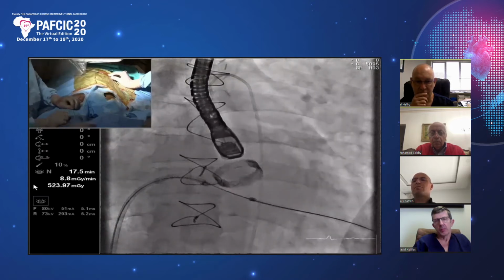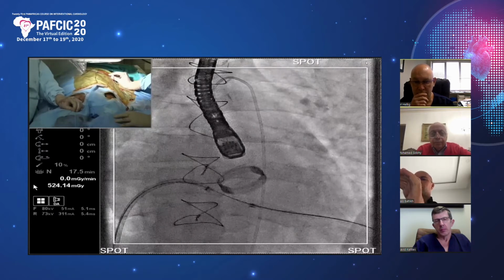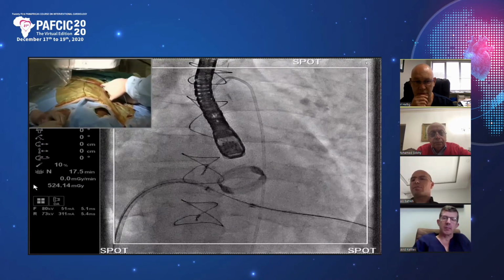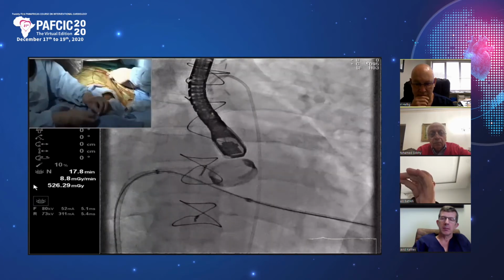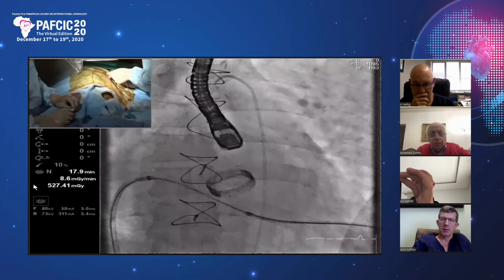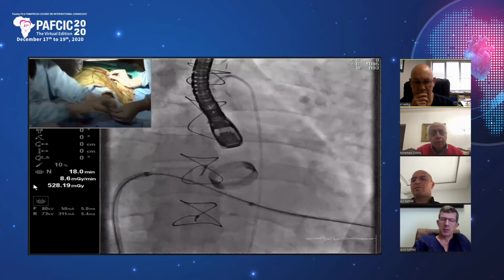And then we will take a guiding catheter from Shaheen's end. Give us the guide, and the guiding catheter can accommodate 2 wires. So Shaheen's going to push the guide in. Screen, please. We need to make sure the guide goes into the sheath, so you often need to rotate a bit. There it goes. Okay, just go slowly because we don't want everything to come. You want to get the wire. Okay, it's got the wire, so you can pull a bit more wire.